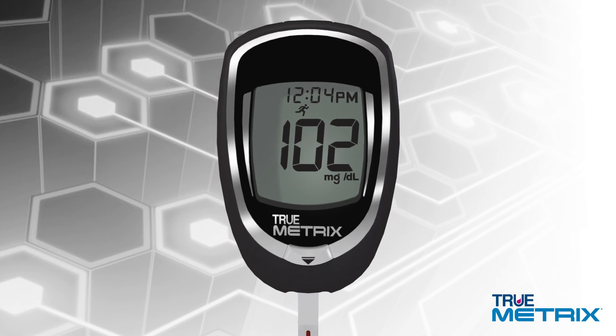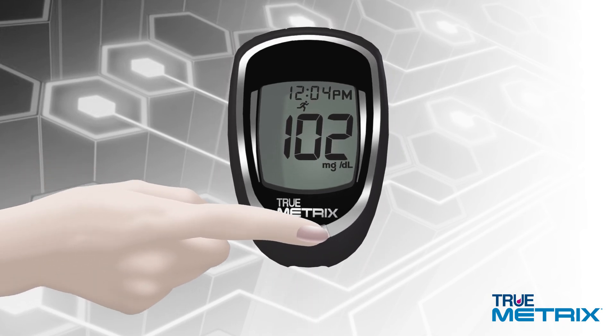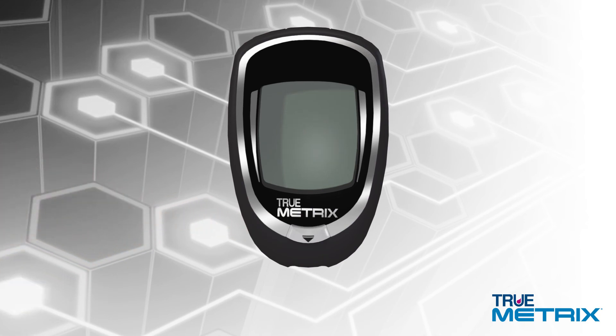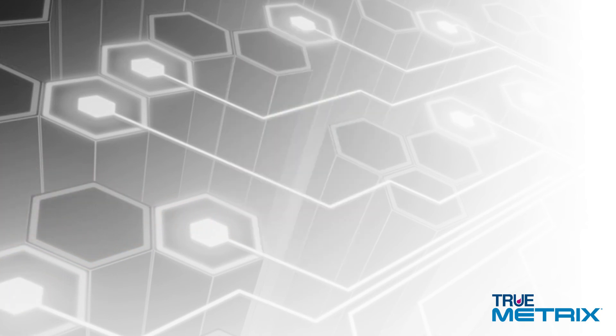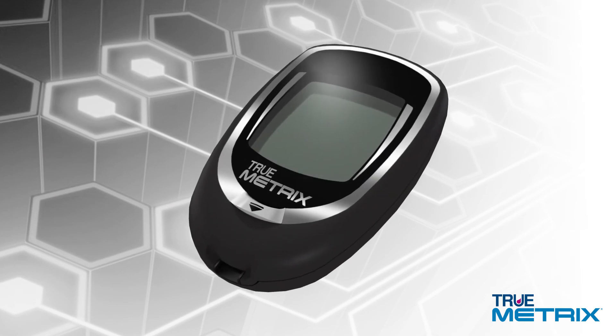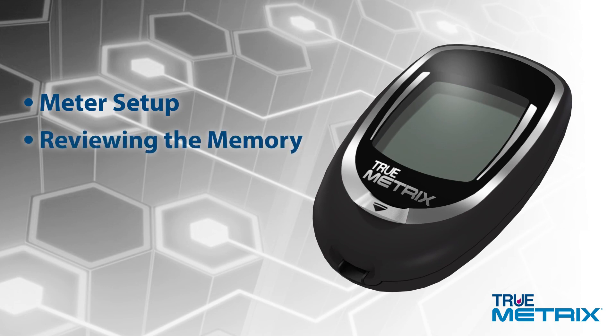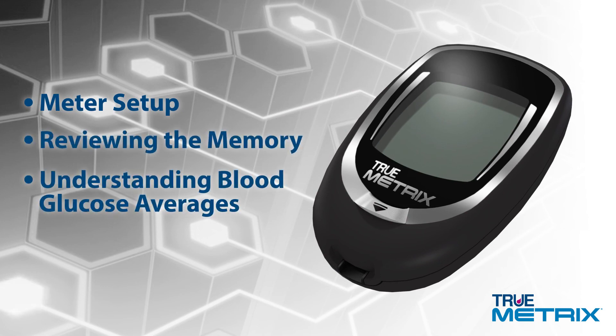Afterwards, hold your meter with the test strip pointing down and press the test strip release button to discard the test strip. The meter automatically turns off. That is it — you have just completed a blood glucose test. For information on meter setup, reviewing the memory, or understanding your blood glucose averages, check your owner's booklet or call our helpful customer care staff.